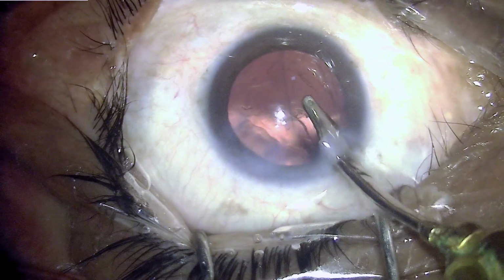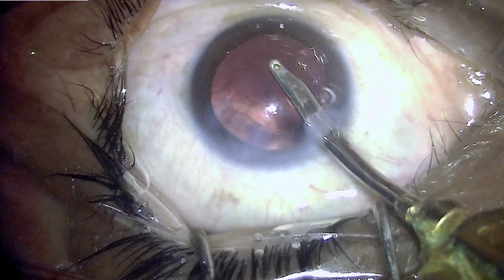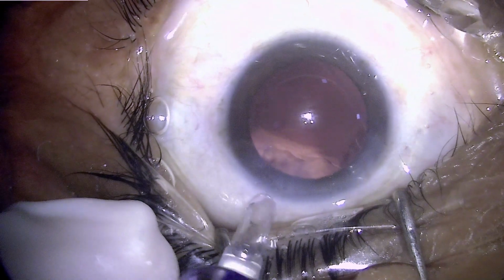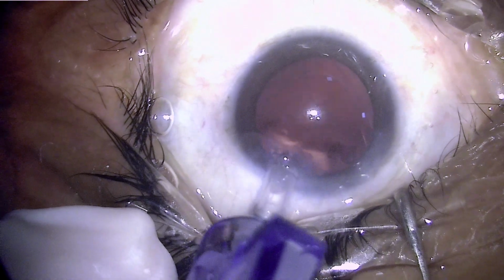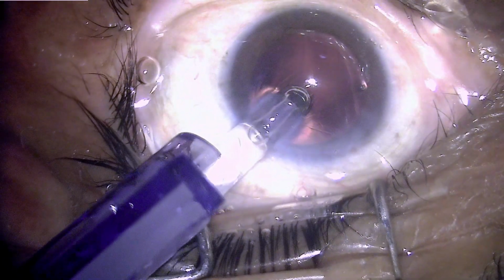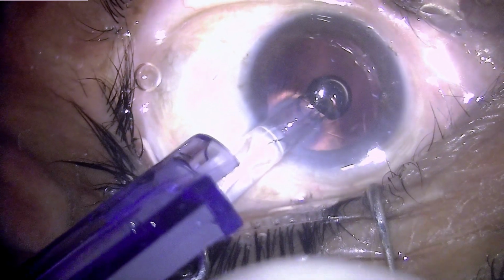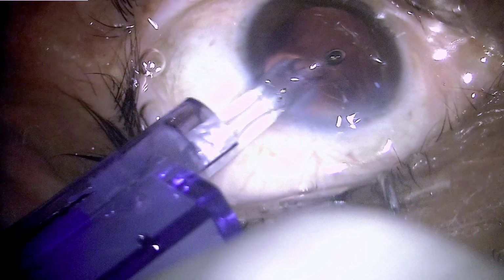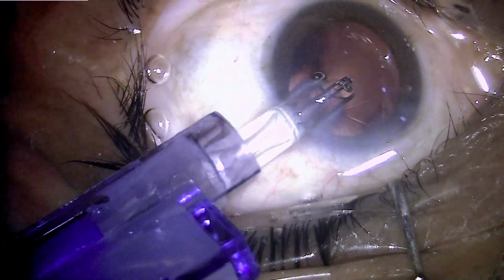Here we can again see the PC rupture, and because there is no vitreous prolapse, we are planning to implant the intraocular lens, but I can see that the rupture on the PC is from one clock hour to the other. It is diagonally set, so it is better not to implant the IOL in the bag. It will definitely sink down later on, rather than placing the IOL in the sulcus.